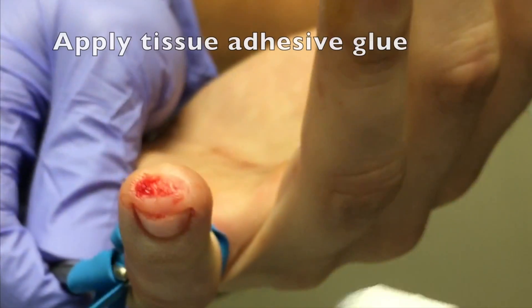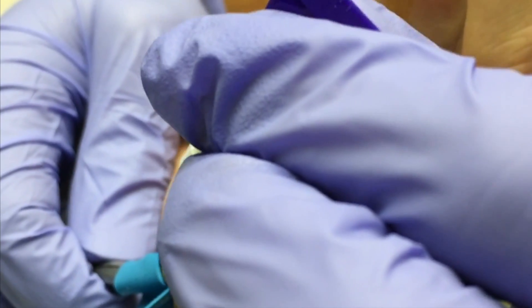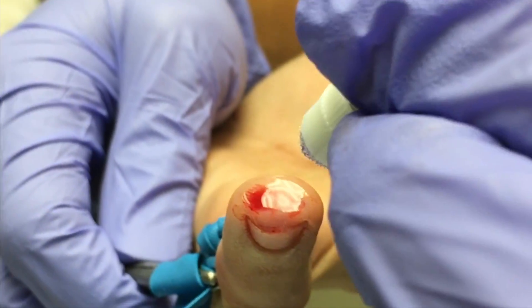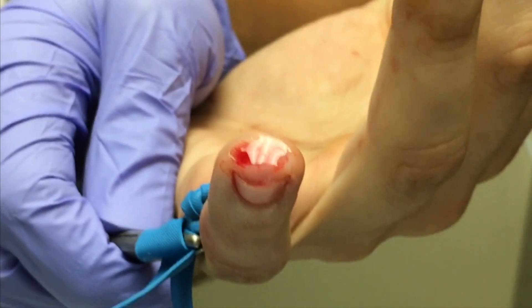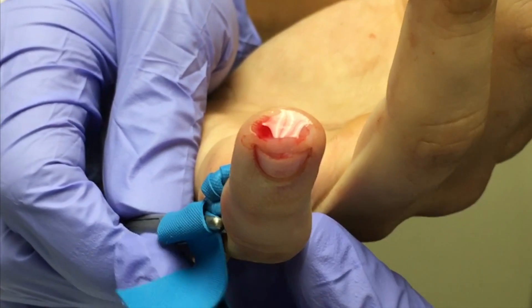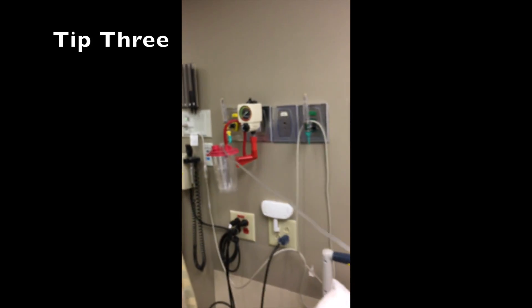Then, and only then, can you proceed with the next step, which is to apply layers of tissue adhesive glue over the injury site. Multiple layers can be used to ensure adequate coverage and hemostasis. As you can see, that glue forms a thick pool, especially in deeper pits of wounds. Here is a third tip to help combat this problem.